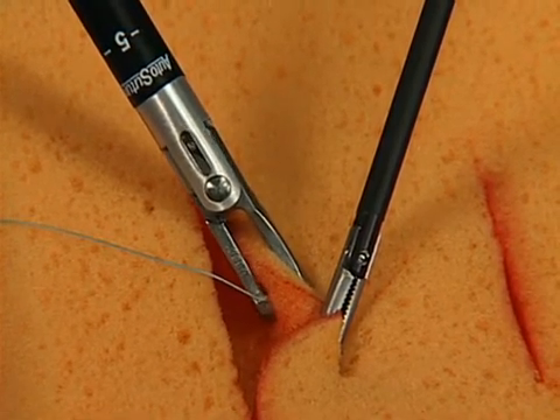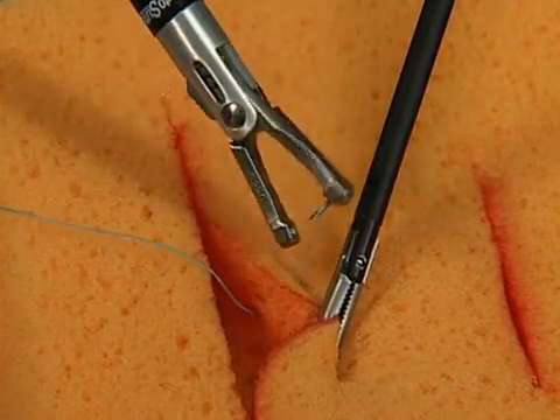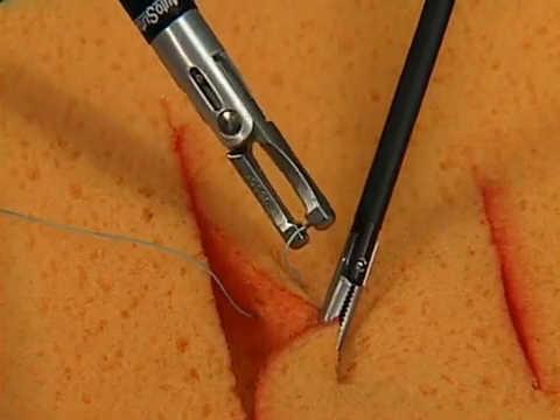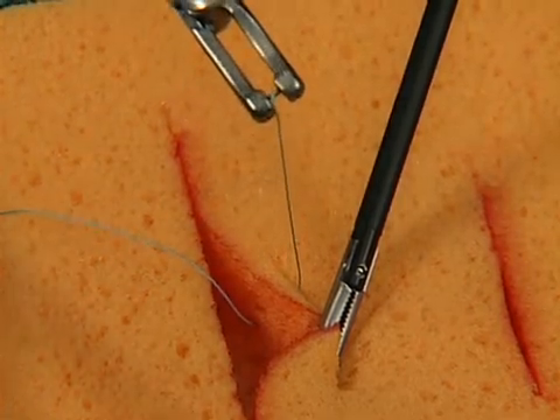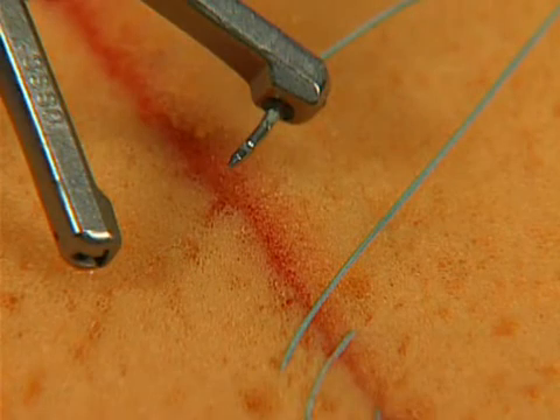Open the jaws by releasing the handle to remove the needle from the tissue. Close the jaws and pull the suture through the tissue, leaving a tail. Repeat this action to place a running or interrupted stitch using endoscopic knot-tying techniques until the stitch is complete.